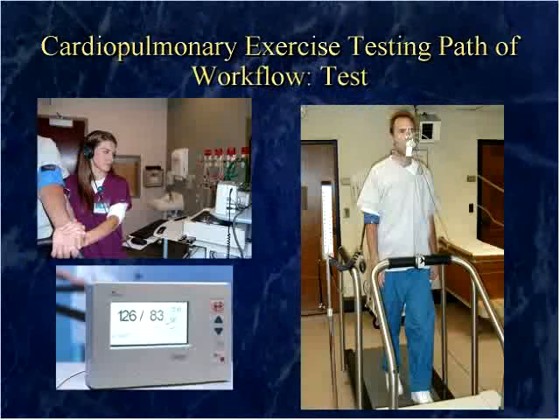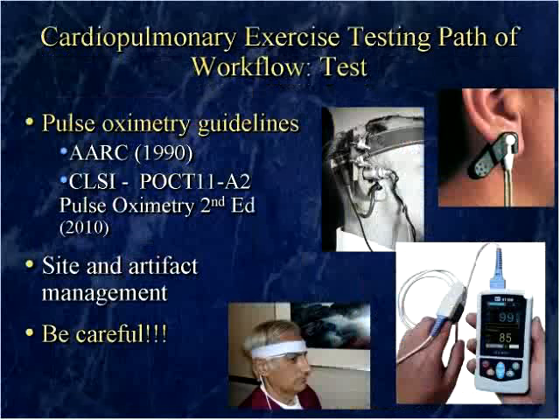And here Katrina, one of the supervisors in the lab, is measuring someone's blood pressure. She cradles the arm. This particular device has a microphone system in it, so you can hear the Korotkoff sounds nice and loud with a microphone within the bladder of the cuff. And if you're using standardized blood pressure testing, make sure that the manometer that you're looking at is at eye height, so that you aren't influencing the measurement by having something that's very low to the ground and you're looking down on it, or very high. So just make sure that it's standard height when you check the blood pressure.